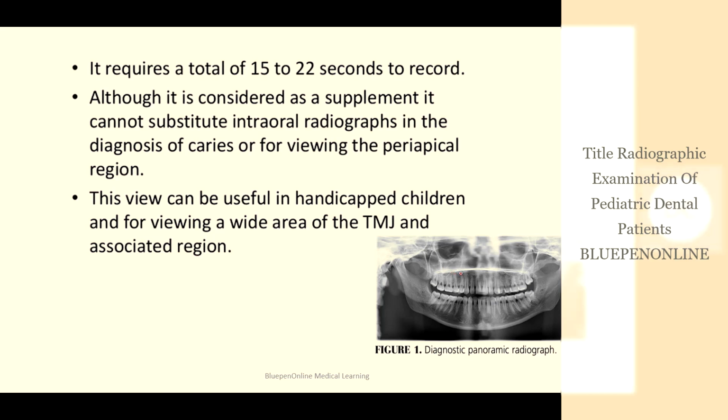This is especially useful in case of handicapped children, but the only requirement is they have to be stabilized for around 15 seconds.